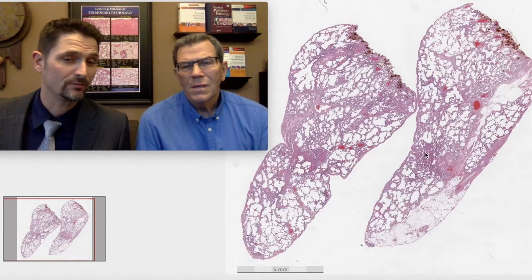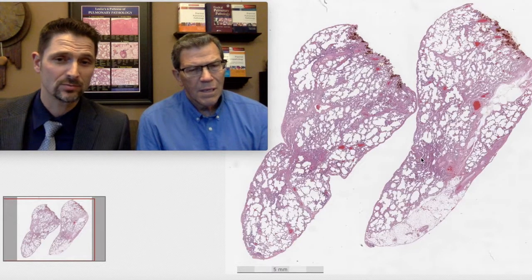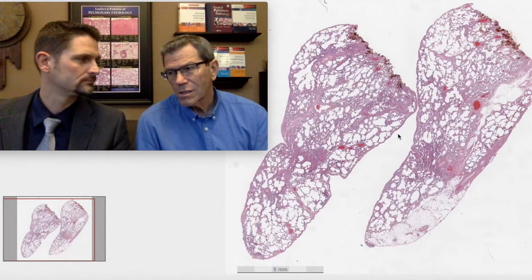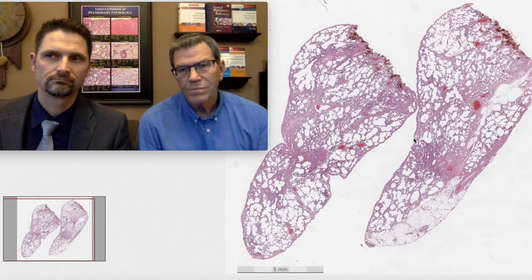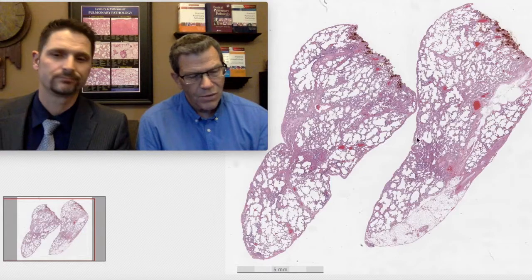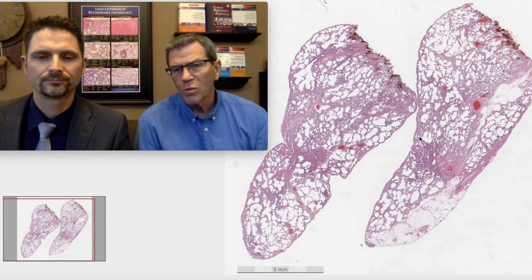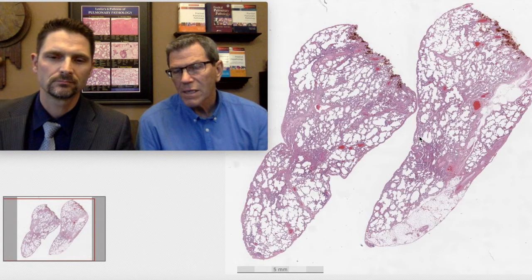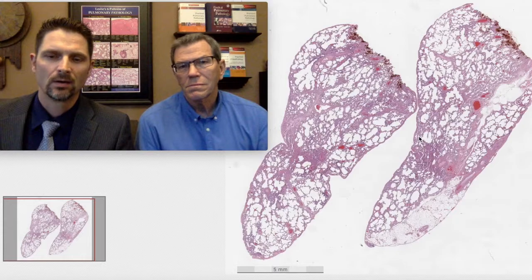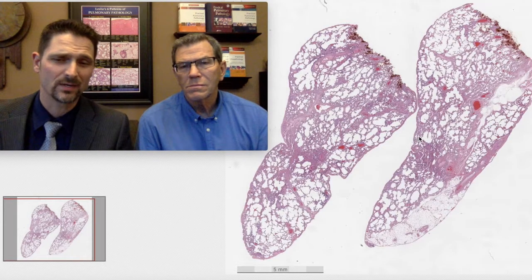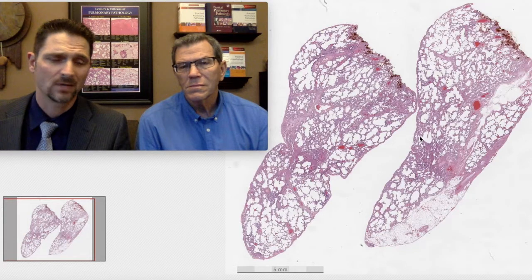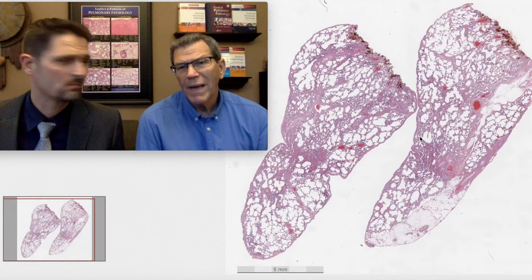When you've got a patchy distribution, if it's patchy and nodular, always think about airway-associated disease, which are inhalational diseases. Sometimes autoimmune, but mainly inhalational. So from low power, it's a blue biopsy, a little bit accentuated in the central lobular regions, and it's patchy.